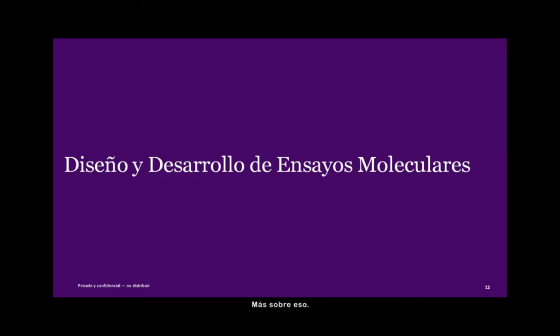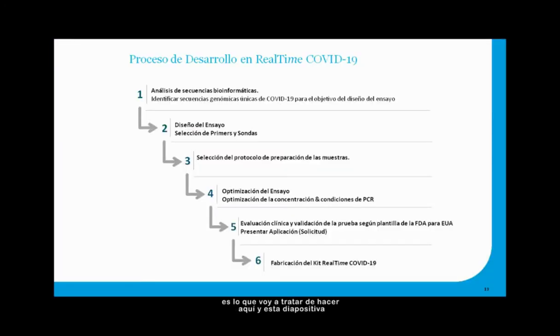More on that. Now to talk about the design and development of the different assays that we worked on, and to put you in the mind frame, the space that we were in, is what I'll attempt to do here. This slide speaks to the different things you've got to do normally when you're developing an assay. I think many people on the call today will be familiar with that.